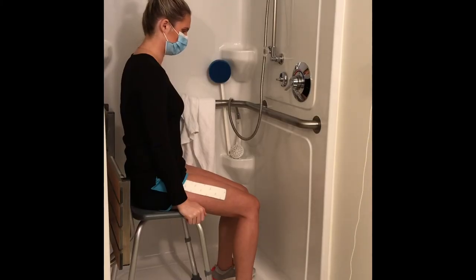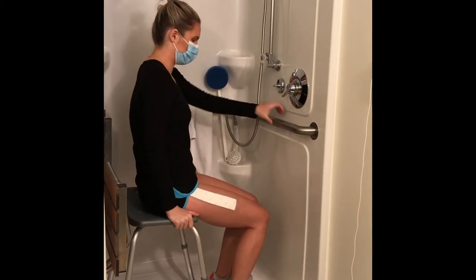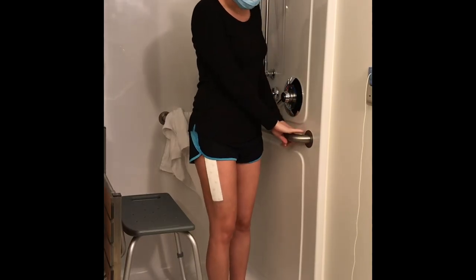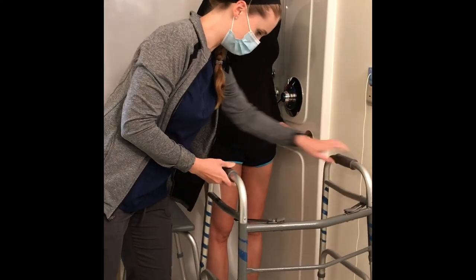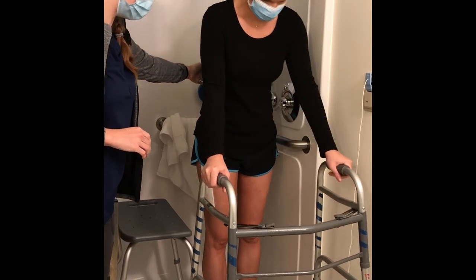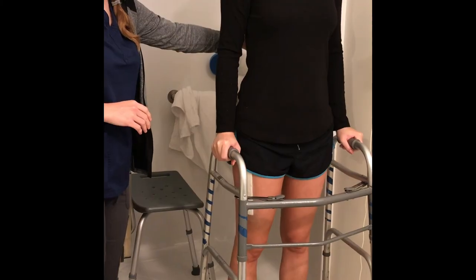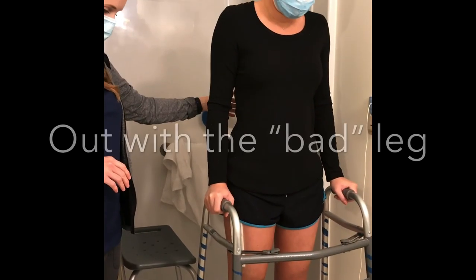When getting out of the shower, scoot toward the edge of the shower chair, then push off the seat to stand. Turn your body to face the outside of the shower — you can use grab bars to do this safely. Your caregiver should position your rolling walker in front of you outside of the shower. While holding onto the walker, step out with your surgical leg first, then with your non-surgical leg. The order for getting out of the shower is the same as when you're climbing down stairs — out with the bad leg.